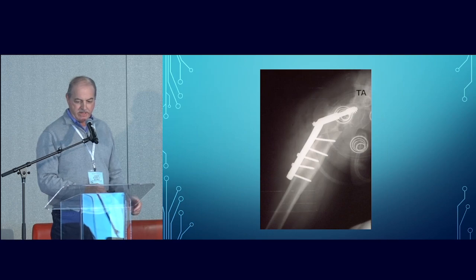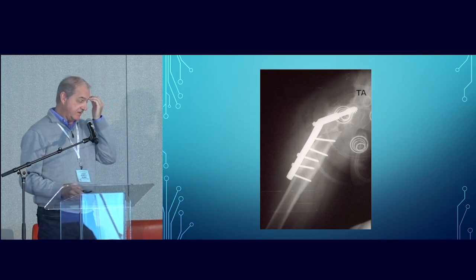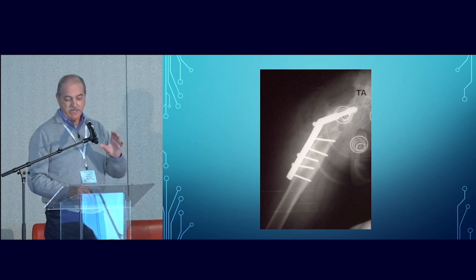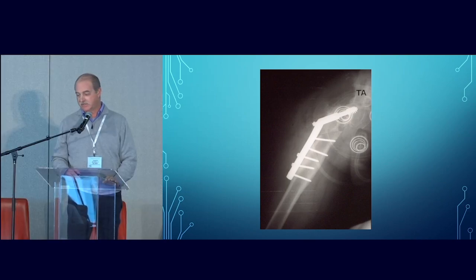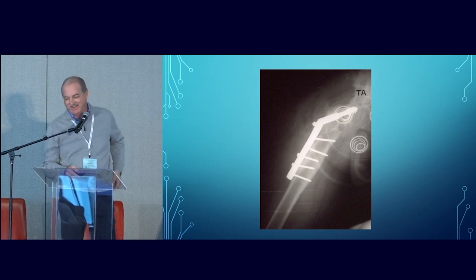So Kyle went and fixed it with the dynamic hip screw, which I'm already tired of hearing about this meeting. And then he put the drain right over the top so the x-rays kind of cover up his poor reduction. I haven't gotten involved yet. You'll see when I do. Oh, is that right?